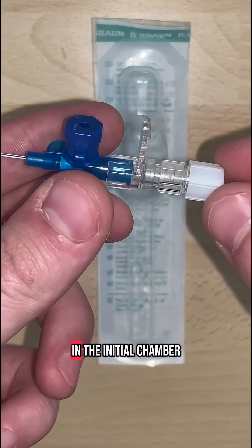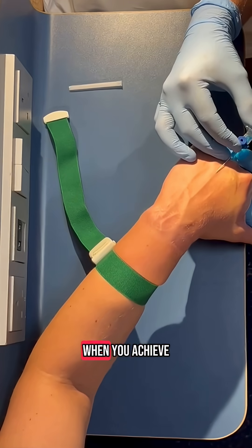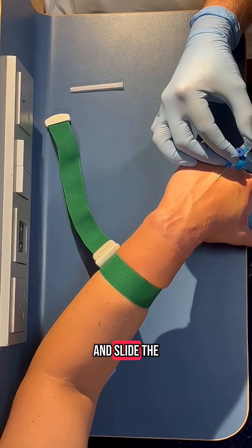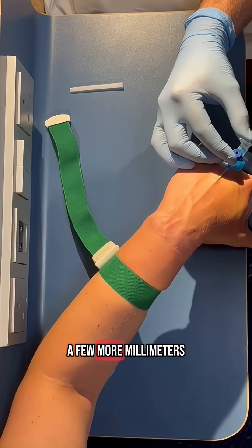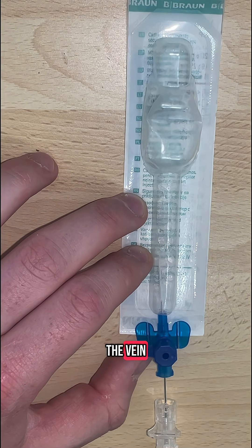Obtaining first flash in the initial chamber suggests that your needle is inside the vein. When you achieve this, level off your angle even more and slide the entire device forward a few more millimetres. This will ensure that both the needle and the plastic catheter are inside the vein.